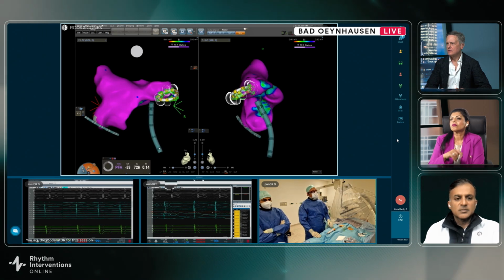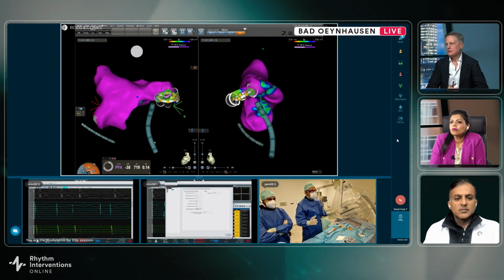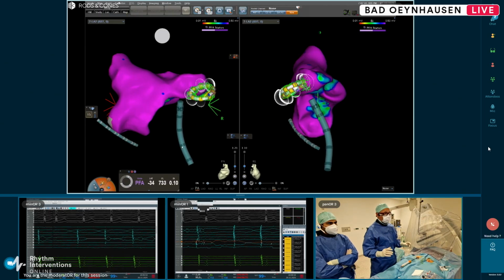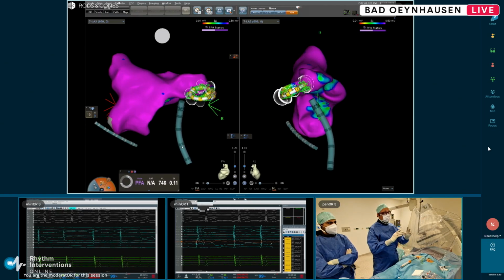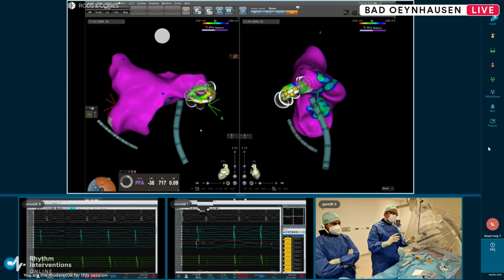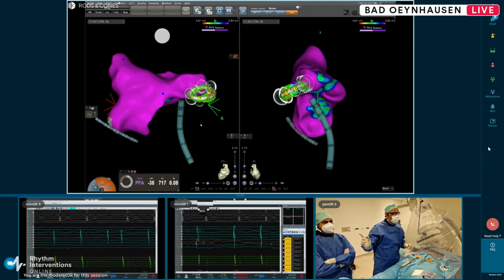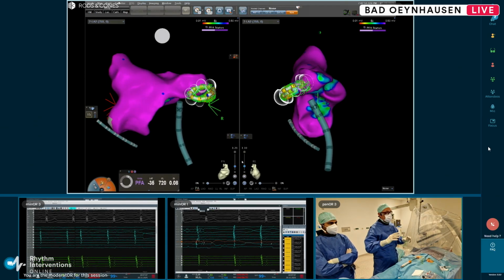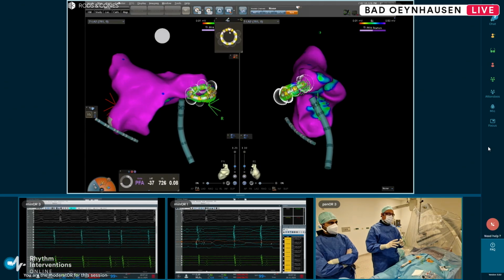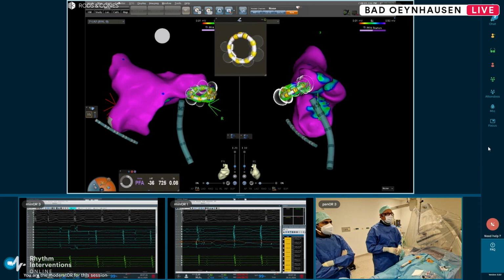Yeah. You can see it now at this time. The catheter is now more or less in a vein position, even if it's not a good one at this time. I agree, and we don't have the anatomy, but you can clearly see these bubbles, and they show us that we have a good TPI measurement at this time. If Mr. Erdem can show us the bullseye here in the middle, you can even see this a little bit nicer projected, so that we can finally use this TPI in terms of lesion application on the one hand.